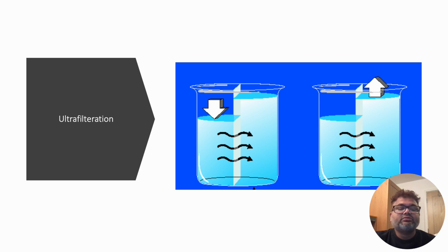The next mechanism under discussion is ultrafiltration. So try to remember, ultrafiltration is nothing more than squeezing blood through a semi-permeable membrane, and it is responsible mainly for removal of fluid, removal of water, with probably some of the electrolytes. It works by the mechanism of pressure.